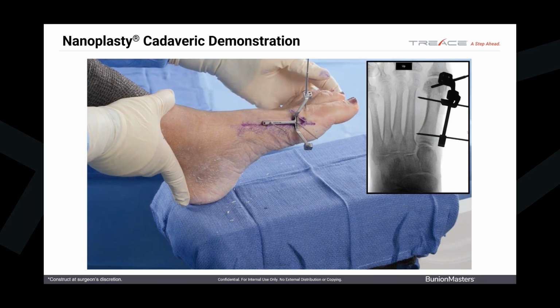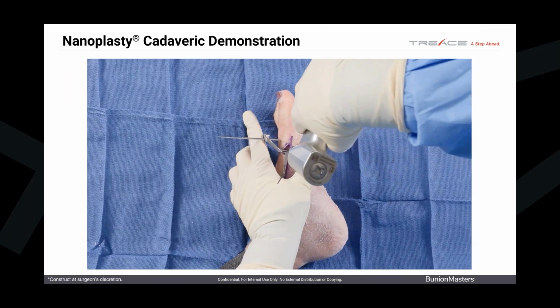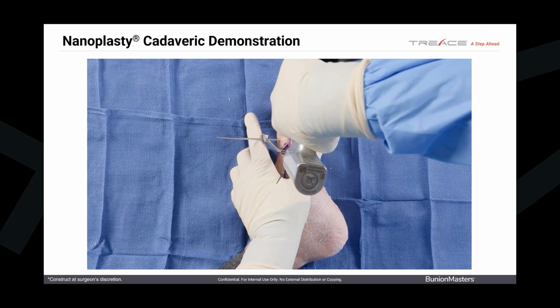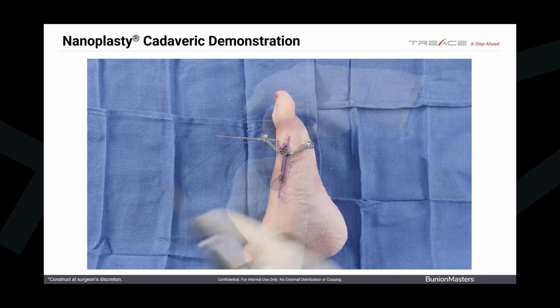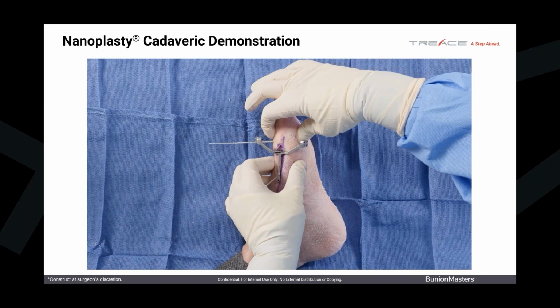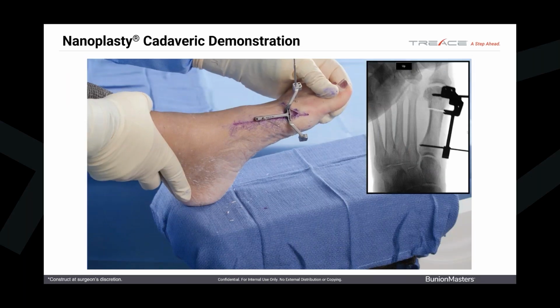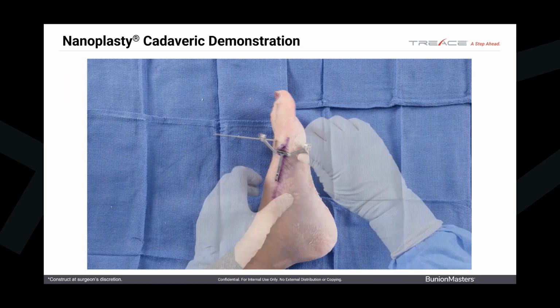So now we'll remove the center pin because we have to make our osteotomy. And we've given you a saw to create this. That is the perfect size and length of this osteotomy. It's in your set. Once you complete it, the capital fragment will rotate and you know you're complete. If you have to go back and angle a little bit to get the dorsal plantar cortex, go ahead and do that. We'll actually pull the proximal pin out at this point and the guide will come off.